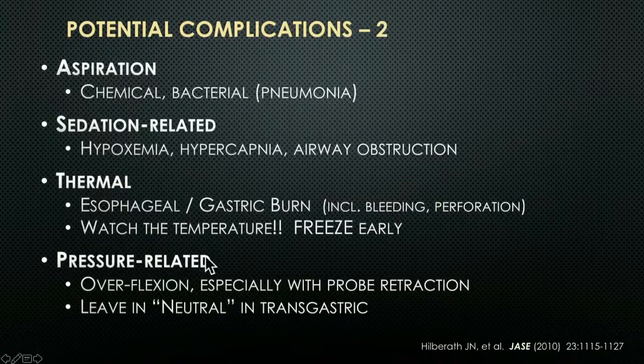There are indeed pressure-related problems. When you have a probe in during an operative procedure, or perhaps for a long procedure for a paravalvular leak closure, and you leave that probe in the esophagus in an anteflexed or retroflexed position, that constant pressure for hours, whether or not you're imaging, can cause a pressure injury.